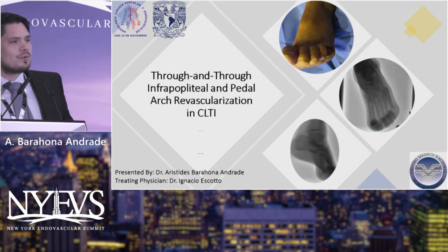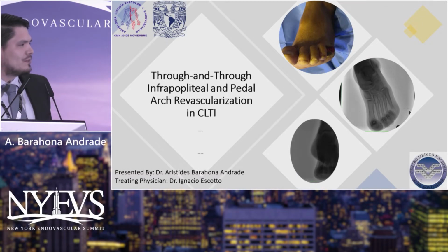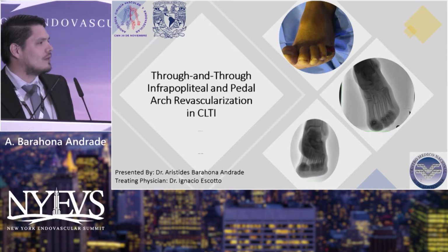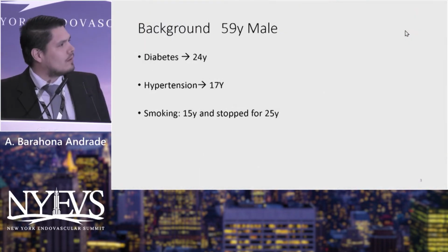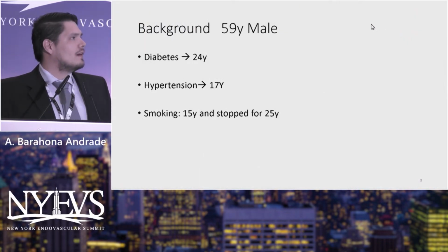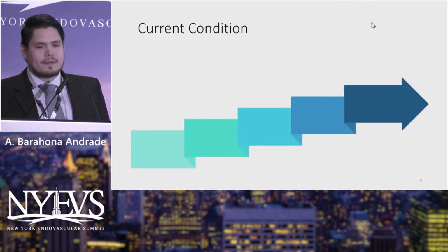Today I'm gonna walk you through one procedure we did with Dr. Ignacio Scotto, one of my teachers. It's a through and through infrapopliteal and pedal arc revascularization. So we're going to be talking about a 59-year-old patient with a history of diabetes, hypertension, and smoking.